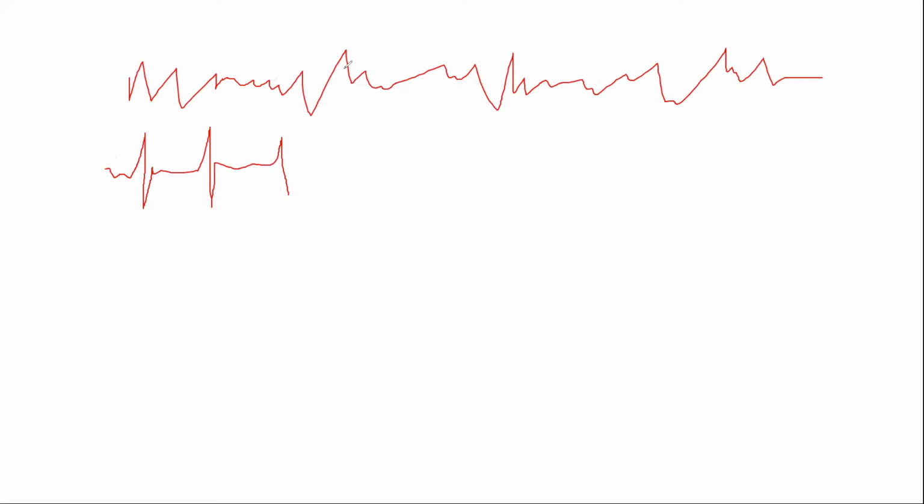And then the EEG is all of this up and down of this electrical current, and it's not as rhythmic as you see in the QRS with the heart, okay? So as we look at this EEG doing all this up and down, the question is, well, what is all of this? Well, it's electrical current, but inside of it are all these different speeds or brain waves. So I want you to try to think of it this way. We've got a slow wave, let's start at the beginning. Delta are the slowest waves possible, okay? And a delta wave, I'll type it here.